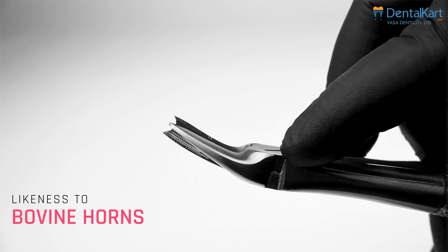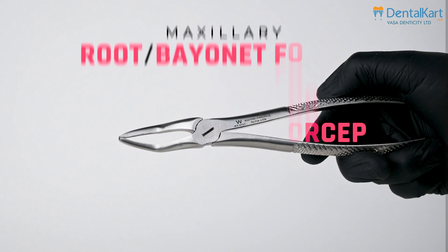The maxillary anterior forcep is designed for extracting the anterior teeth from canine to canine. The forceps have a straight profile; beaks are concave from both sides to accommodate the single root of anterior teeth.